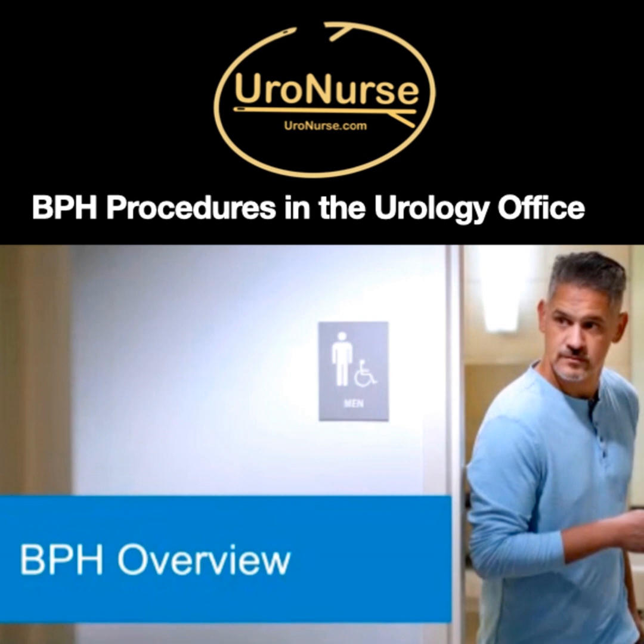There's a few of them, and they will heavily promote this procedure, saying that it's much better tolerated and the short-term irritative symptoms are better. And I do find that to be the case. The short-term irritative symptoms are present. I do think they are a little bit better. I also think that the catheter rates are lower and shorter. So typically after a Urolift, I will put a catheter in for a day and remove the catheter the next day, unless it's a big bloody mess, which can happen sometimes.